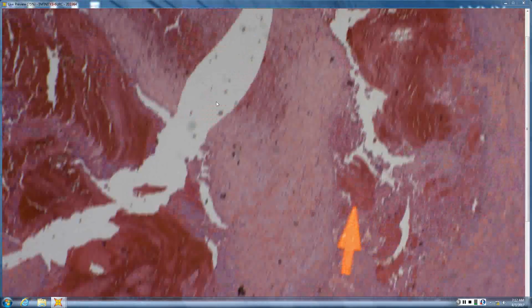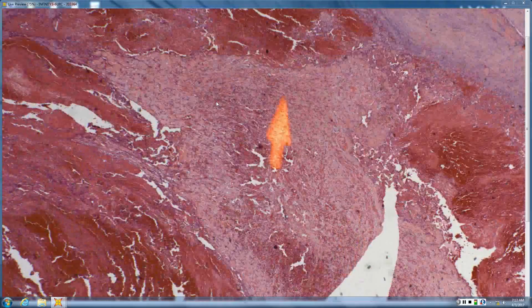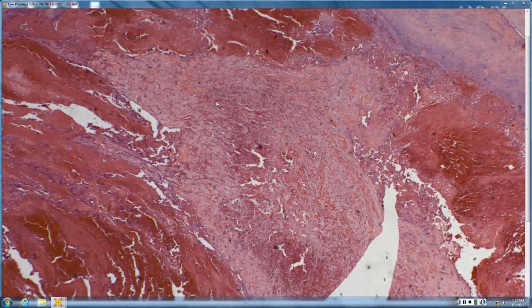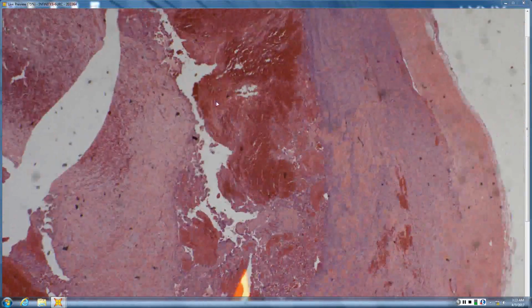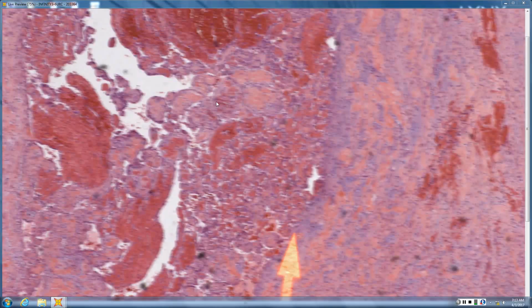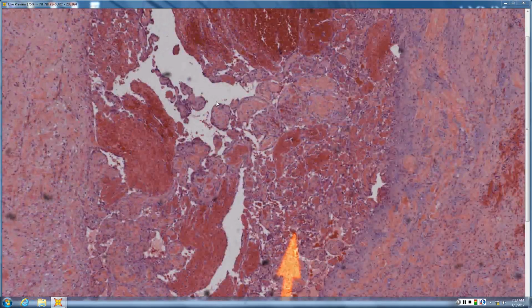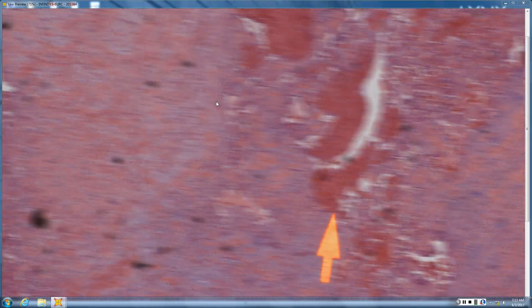Okay, this is another IPEH. And you can see here, it's just this large thrombus, which is basically what all this is here. And over here, different stages. And then over here is where you can start to see that recanalization occurring, giving you that almost proliferative appearance and a little atypical or seemingly atypical slit-like vascular spaces and pseudopapillary signs and things like that. So basically another IPEH. I think there's some more over here, down there.